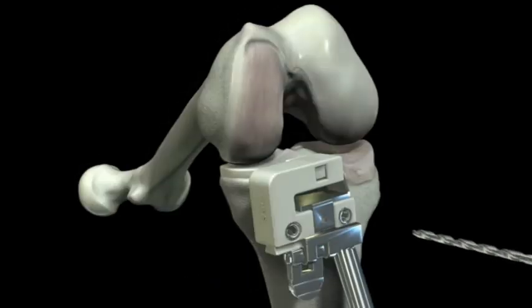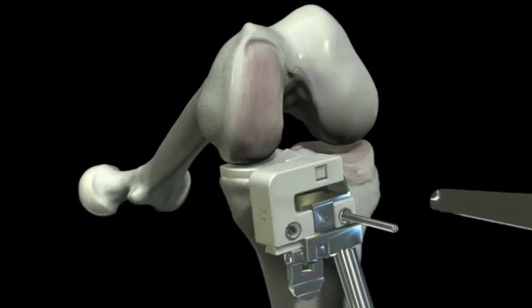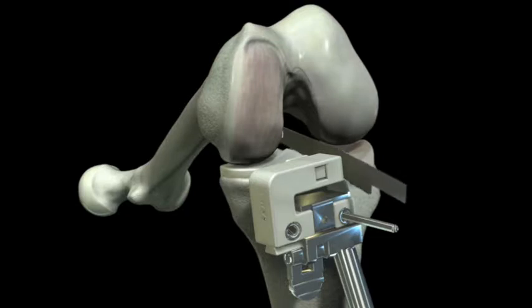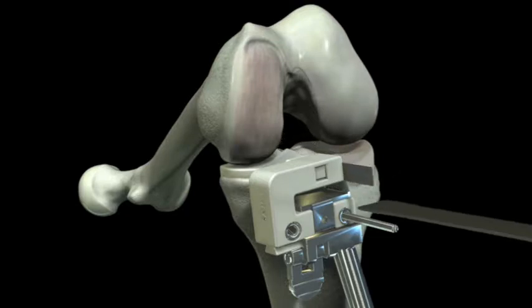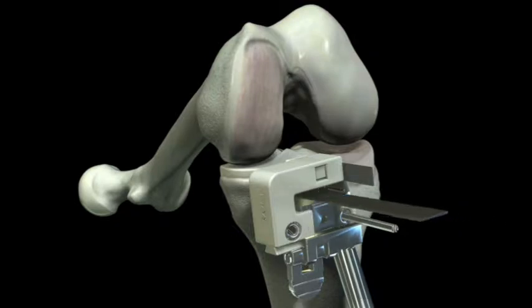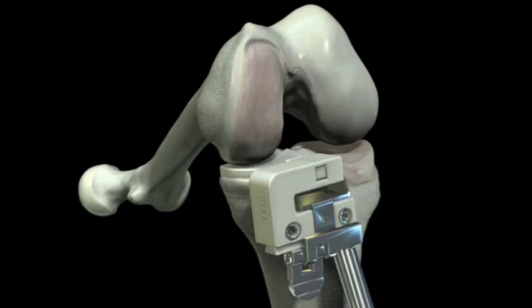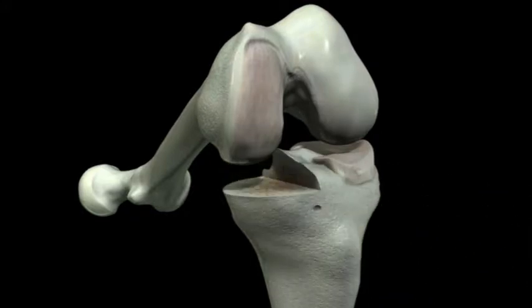Drill and pin the medial hole on the tibial IJIG. With the knee still in flexion, perform the sagittal tibial cut using the tibial IJIG. Note that the reciprocating saw blade can be left in to protect the ACL insertion while performing the axial cut. Perform axial tibial cut referencing off the tibial IJIG. Remove the alignment guide and the tibial IJIG.